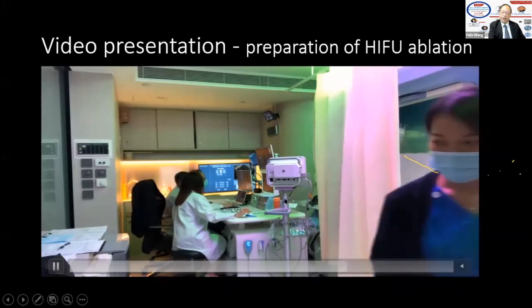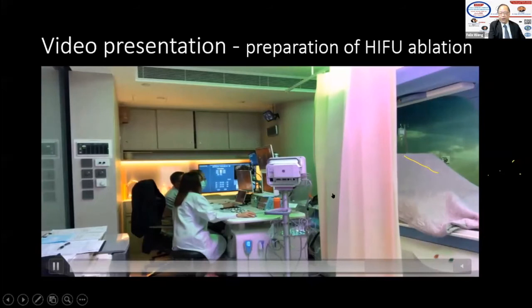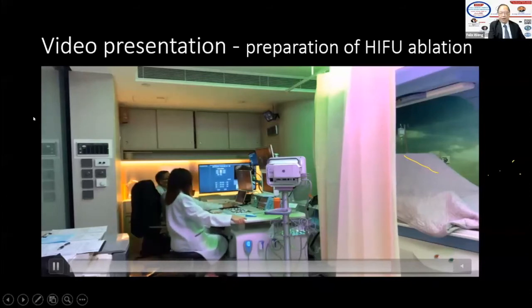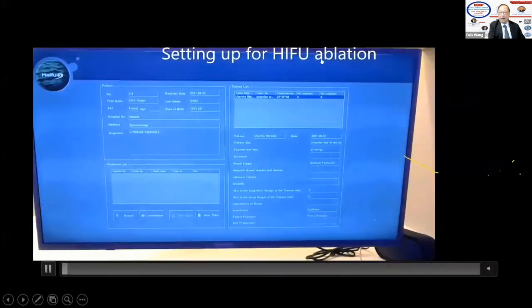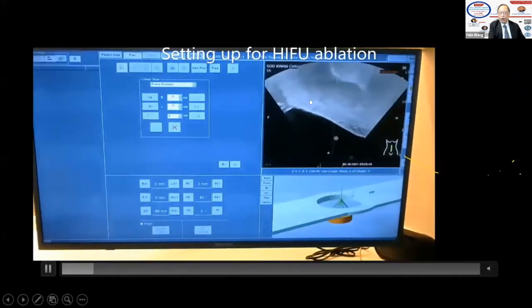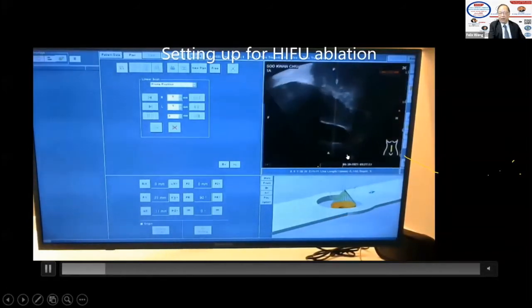At first, I would like to do something with a Zoom, hopefully with this type of platform, to be able to share my operation with other people. However, I find that it's difficult. Now, this is the setup of the HIFU when we first started using a Zoom. To start with, we increase the water level so that it can cover the patient's lower abdomen, because in this way, it will cool down the temperature that may be there.